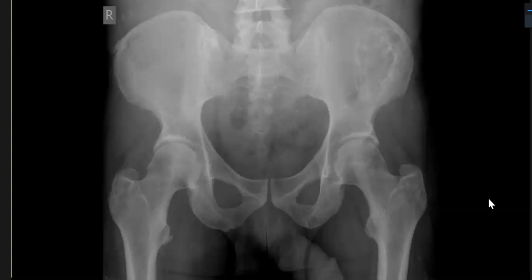You want to see a CT scan? Yes, sir, I asked for a CT. Or MRI would also be fine, but firstly I want to see CT.